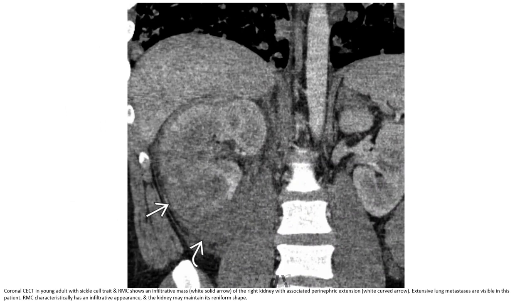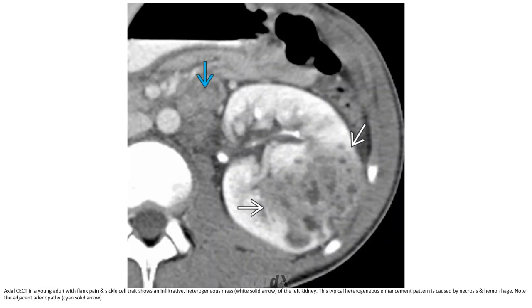Enhancement is very mild but apparent, and the kidney may maintain its reniform shape. On contrast CT in a young adult with flank pain and sickle cell trait, there is a heterogeneous mass of the left kidney. This heterogeneous enhancement pattern is caused by necrosis and hemorrhage.